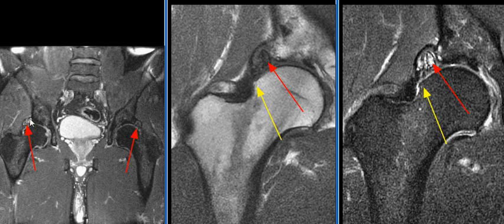An osseous fragment is seen lateral to the acetabular rim, bilaterally, consistent with os acetabuli.